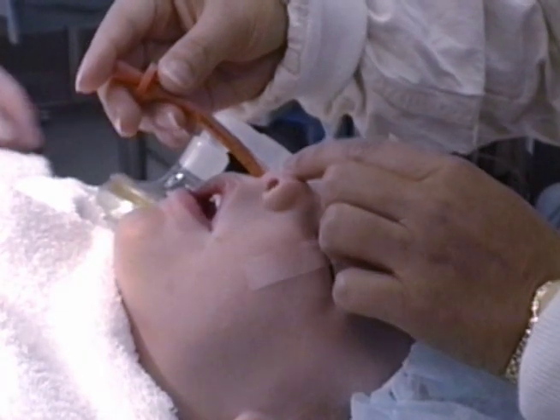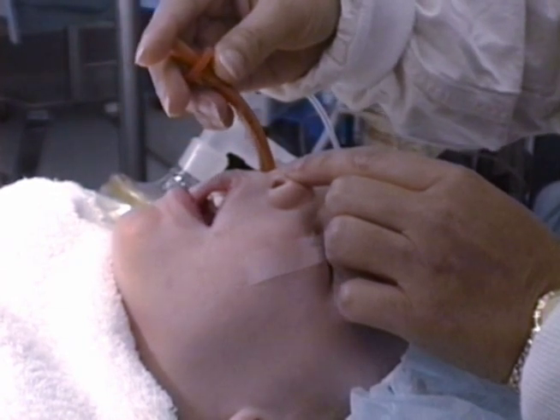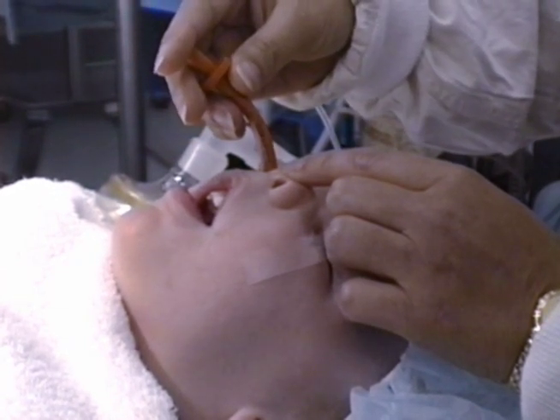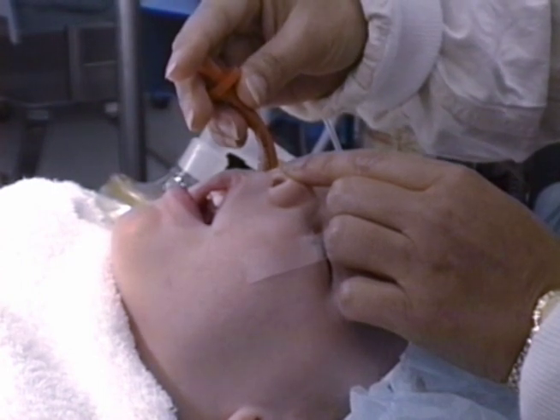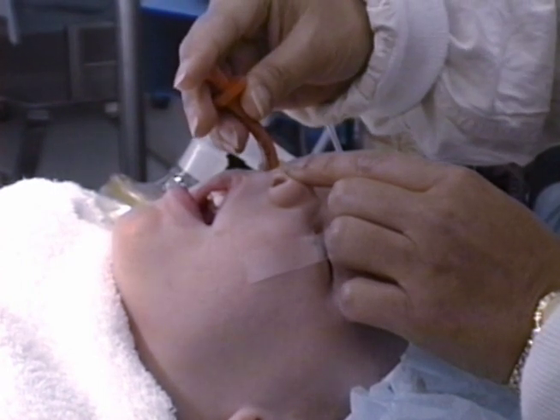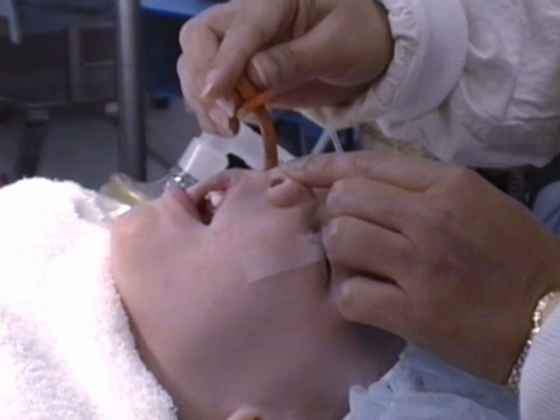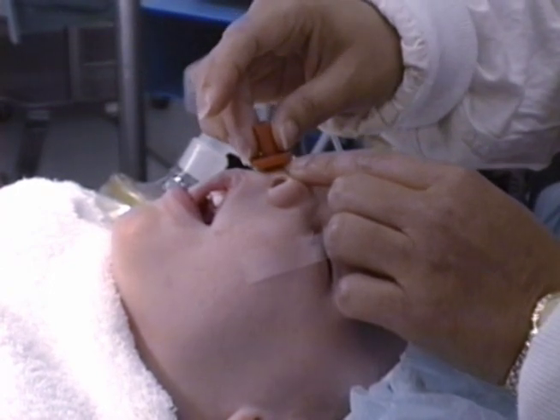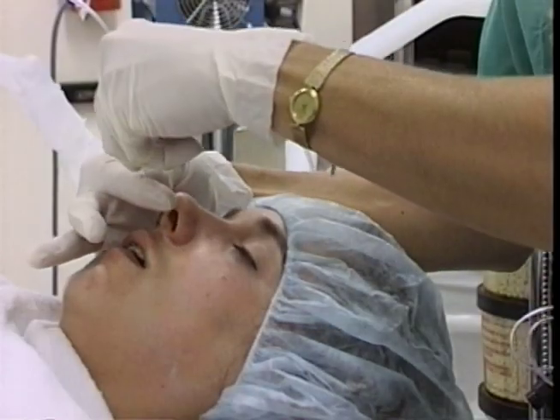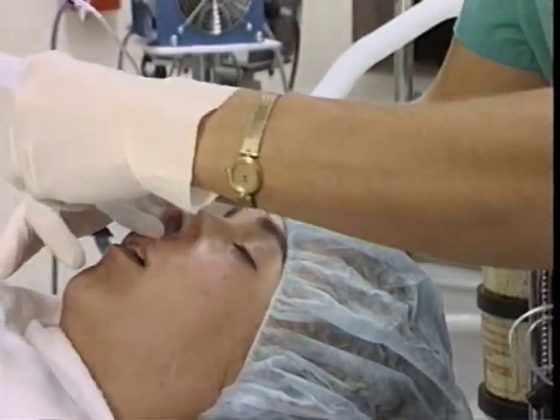Never force it. If you meet an obstruction, try rotating the nasal airway as you advance. Adenoidal tissue can plug nasal airways, causing obstruction and potential aspiration of tissue. If it appears plugged, suction the nasal airway to clear it. Choose a smaller size or try the other side if necessary.